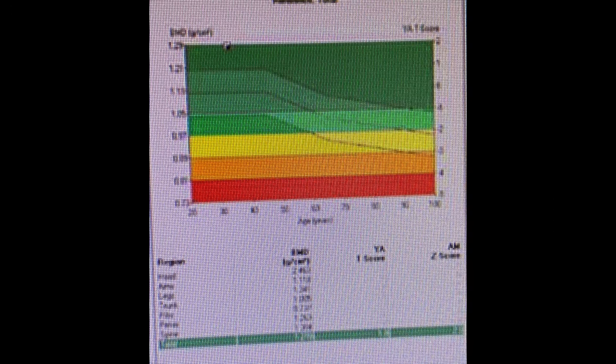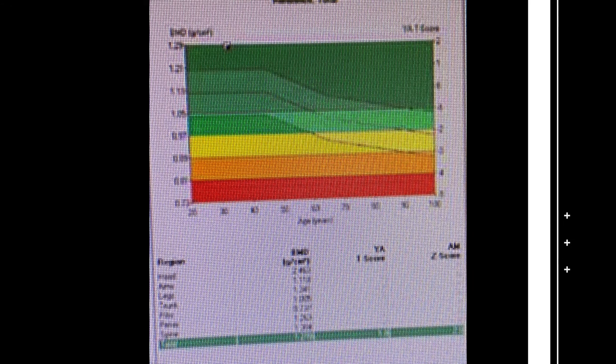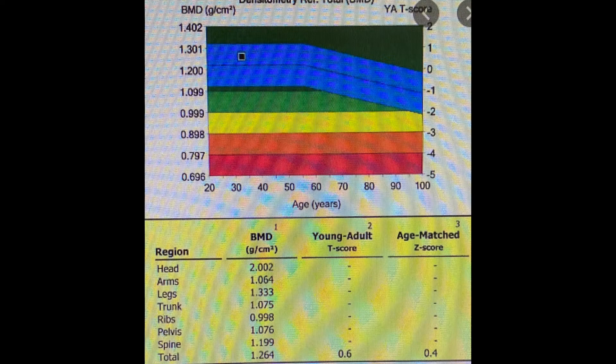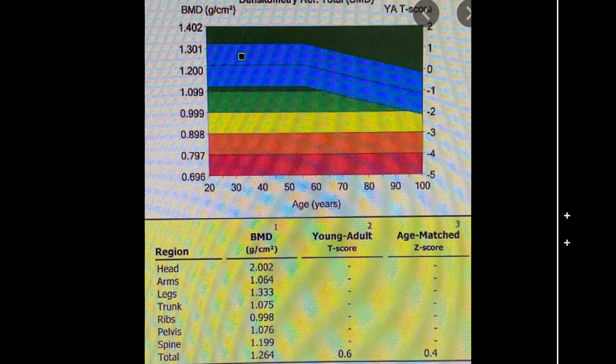Sometimes we also take it from the wrist joint. From this we will have some numbers and diagrammatic information. As you can see, this is a diagram with three colors: a green zone, a yellow zone, and a red zone.